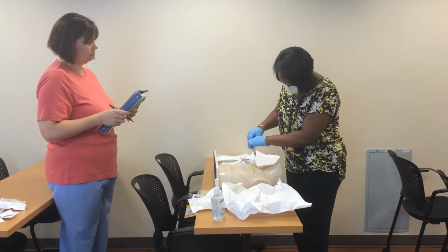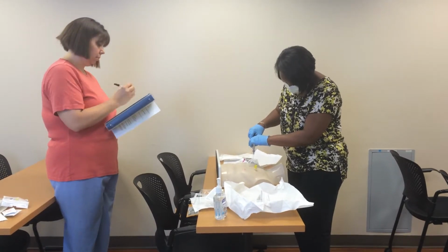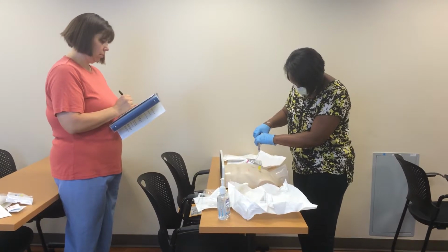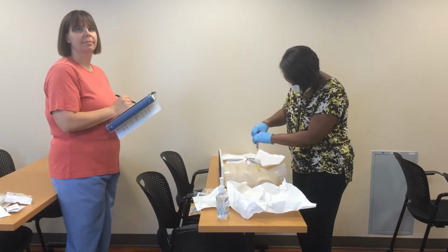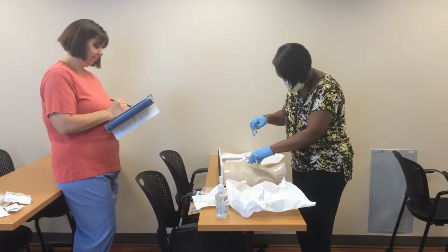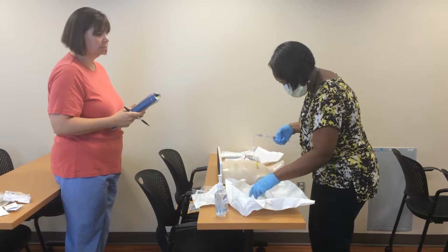All right, feel blood return. How do you feel? I feel fine, thank you. Hardly felt it. That's how I like to do it.